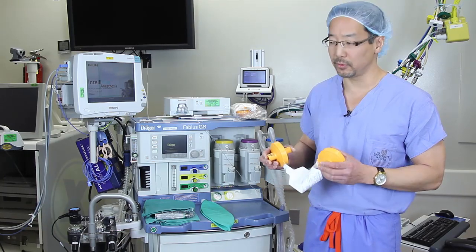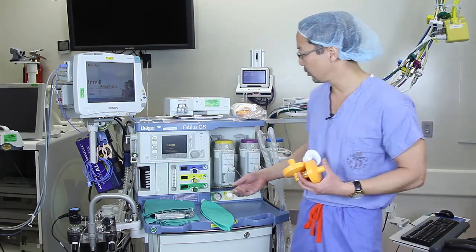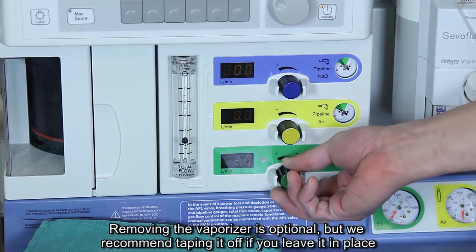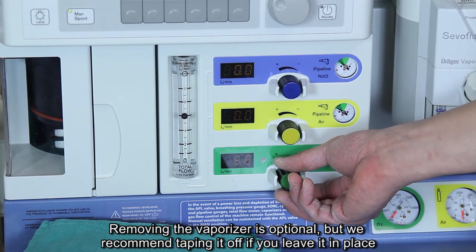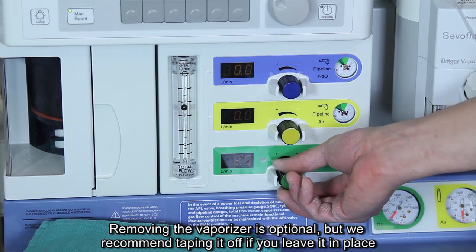The way I'll show you how to do that is: first, we recommend turning your fresh gas flows up to 10 liters per minute or higher for 90 seconds as the appropriate way to get the machine ready.